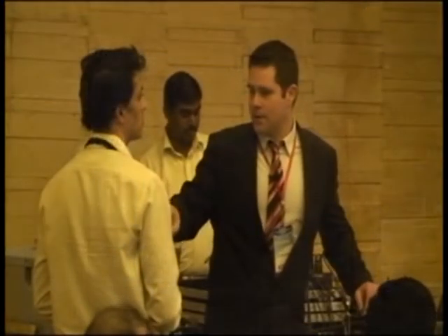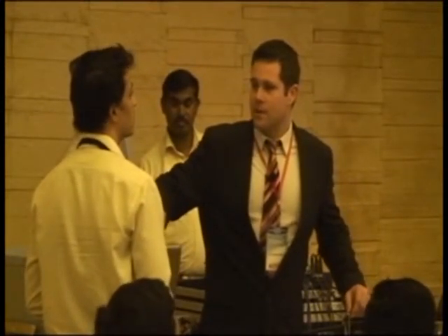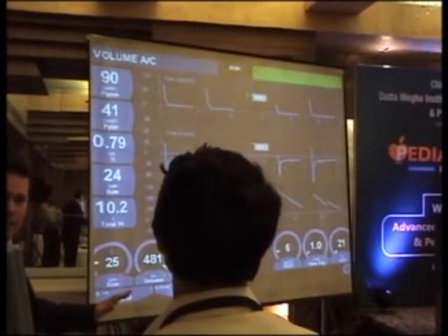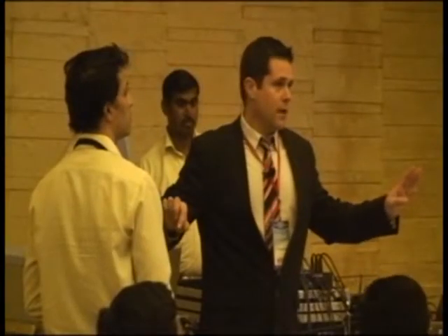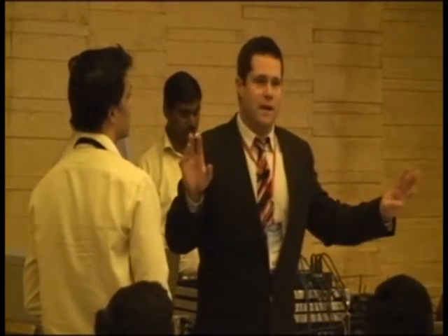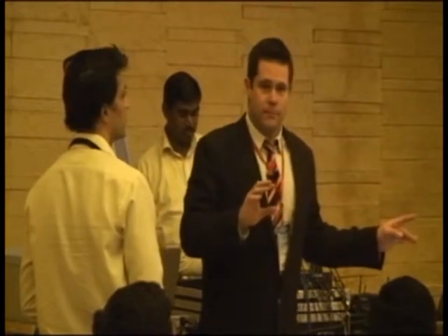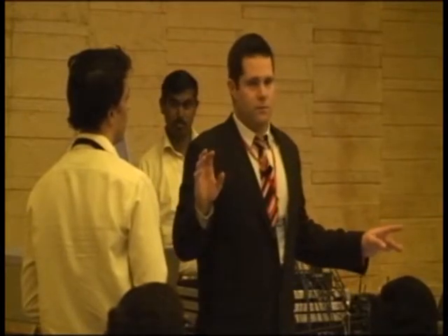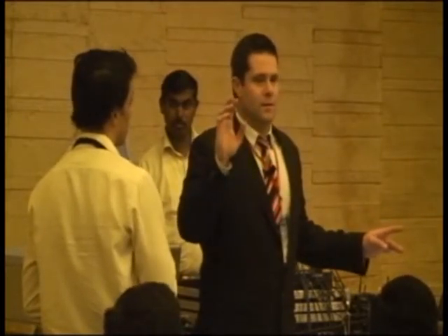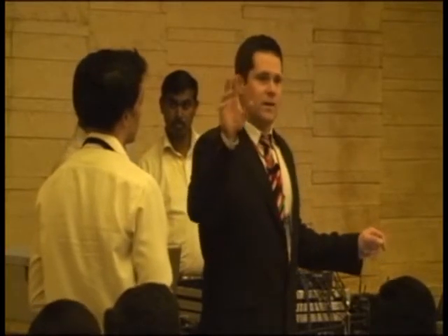Okay? I'm going to freeze that screen. Freeze. Okay? Now let's look. If my inspiratory pressure, oh, it's 90. That inspiratory pressure is okay for that volume because the alveolar pressure is about 40. Okay? So we mentioned before that alveolar pressures greater than 35 are going to be a problem, right? So instead of reducing your rate, what is something else that we can reduce? Tidal volume, because our plateau pressures are greater than 30 something.